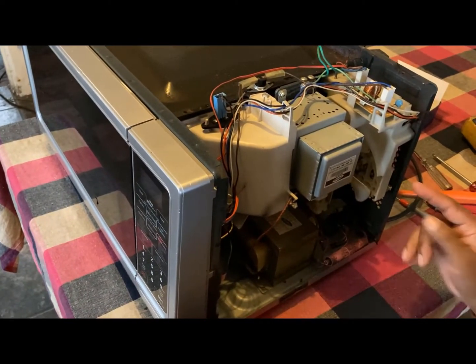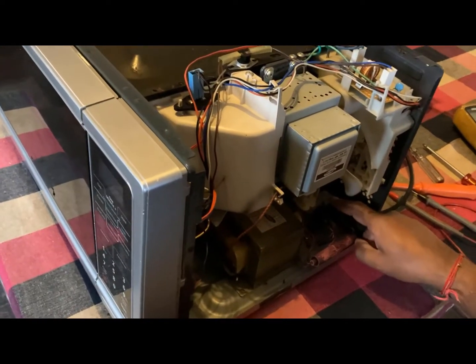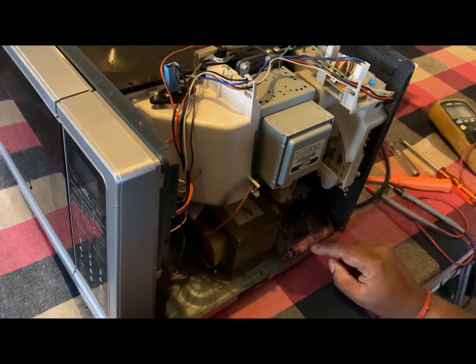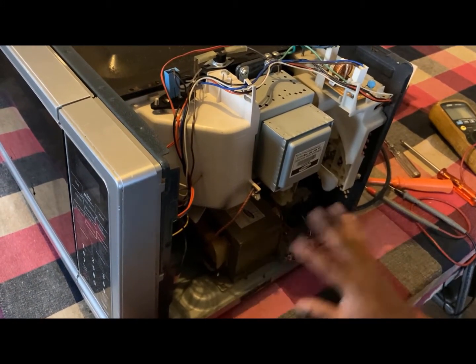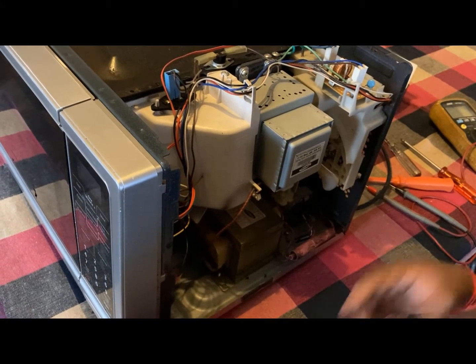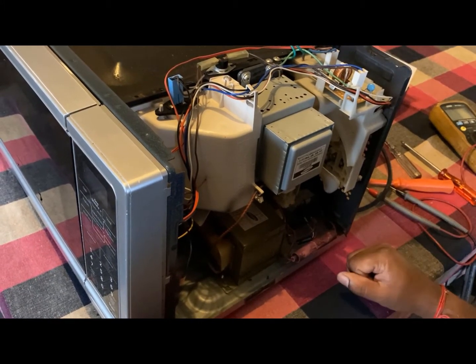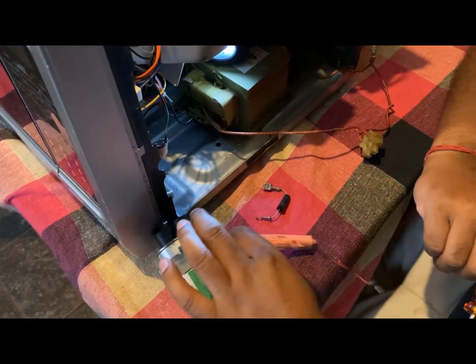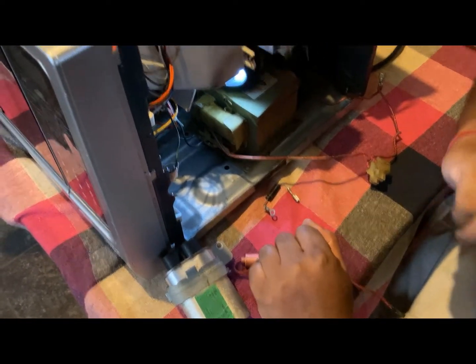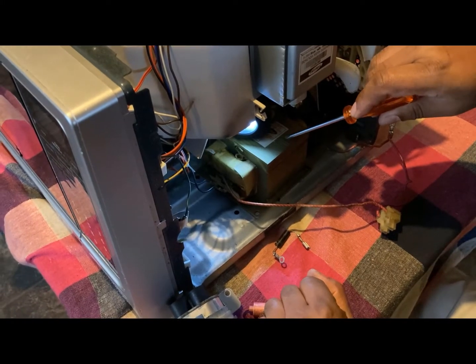So as you can see, the cap is faulty, the diode is faulty, the fuse is faulty, the transformer is faulty. I'm going to remove all those things to make space, and then I'll start with wiring. I've already removed my cap, my fuse, and my diode, and my transformer is already loose.